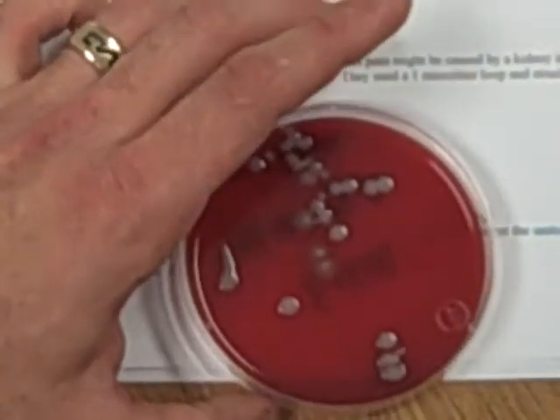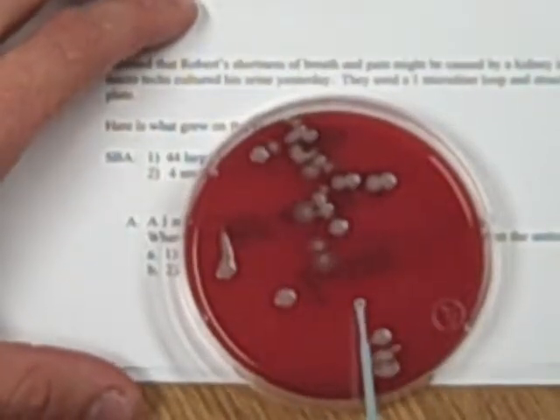So when I give you a problem like this on the test that says, hey, this person has 44 large gray mucoid colonies and 4 small white smooth colonies. Those are just microbiology terminology. You don't need to get too hung up on that. What I would focus on is this 1 and 2 and the 1 and 2 that are located down here at the bottom. You can use that to say, okay, number 1, 44 large gray mucoid colonies. That's probably about what this looks like if these were all the same.